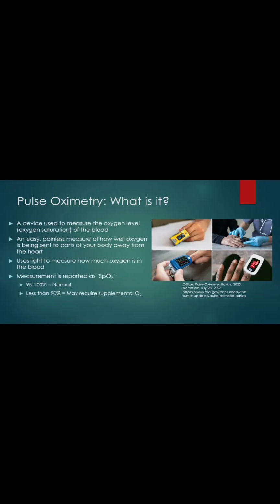And then the numbers based off of those: anything between 95 to 100% is within normal range. Anything less than 90% may require some supplemental oxygen via oxygen tank, and may also be some clinical considerations when planning a course for treatment.